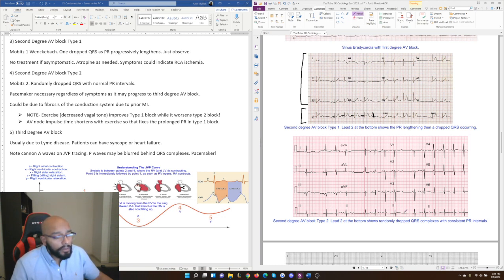And then randomly, you're missing QRS complexes, right? You're missing one right here, right? You're missing one right here. So, and even over here. See, in this area right here, you're just missing one. After this happened, you're just missing one. Then you have 3 normal things. Then you're missing one. Then you have 4 normal things. Then you're missing one. Then you have a bunch of normal things, not missing one at all. Nothing missing, right? So you wanna catch that. You can see that in multiple other leads as well. Very good, very nice ECG.